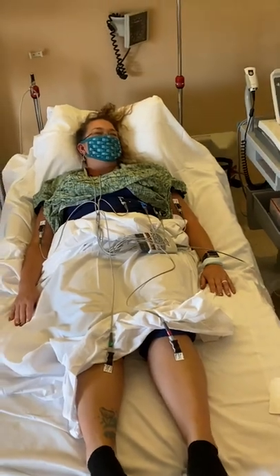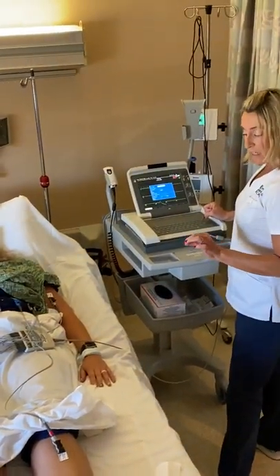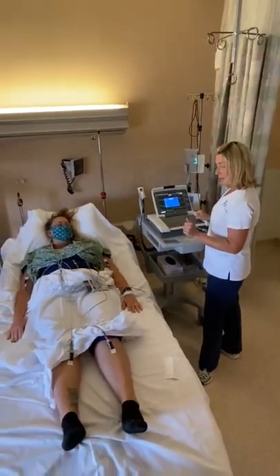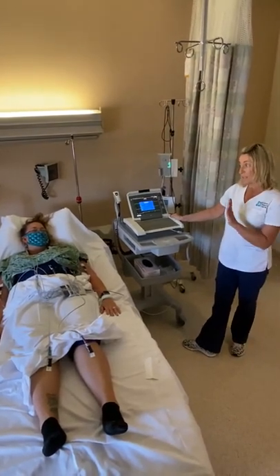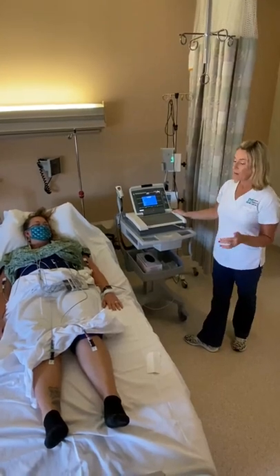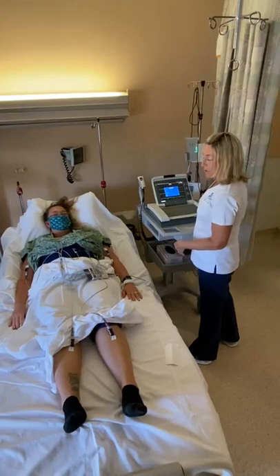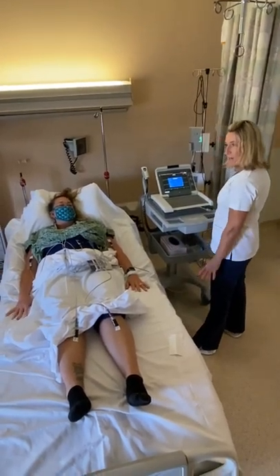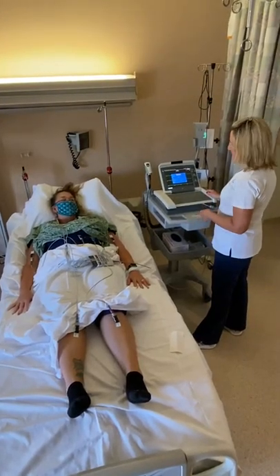Exactly. To ensure the best quality of a tracing, the patient needs to be as flat as they can tolerate. If it is somebody that cannot tolerate being flat at all and needs to stay sitting up, that's okay. But you will get a better quality tracing if the person is able to stay flat. You will also get a better quality tracing if they keep their arms by their side and they're calm. And they're normally calm if you just talk them through it.